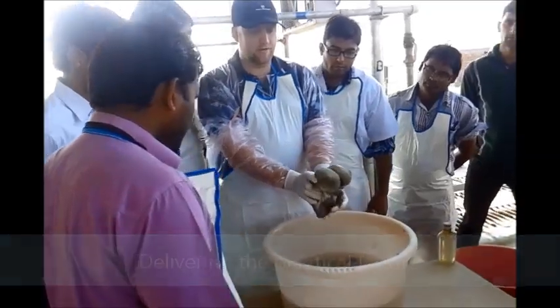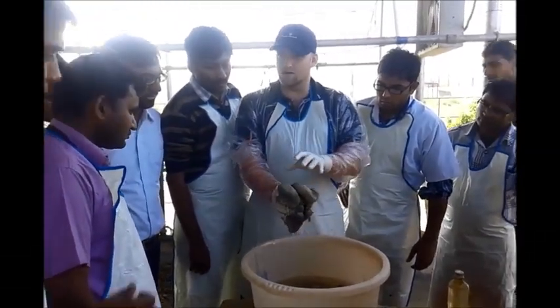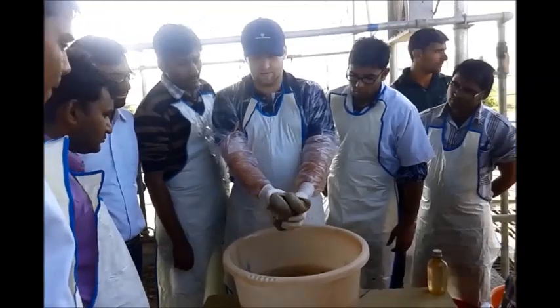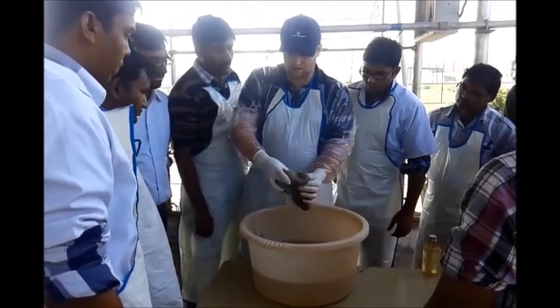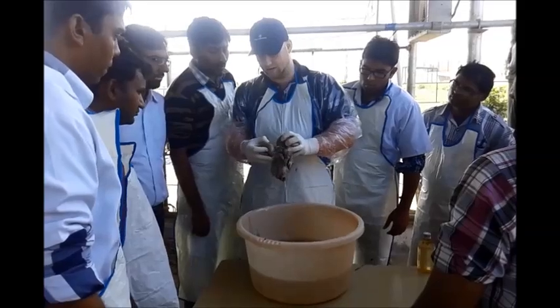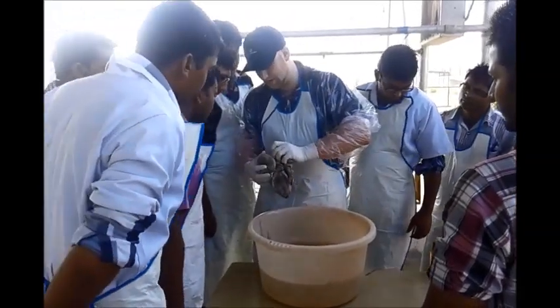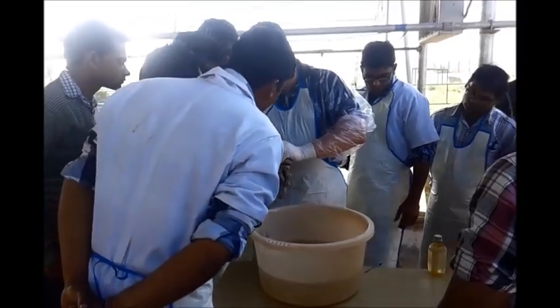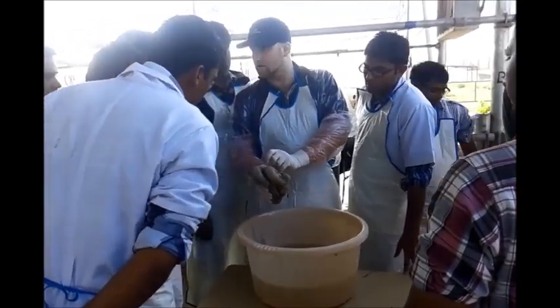At this point I would lift up like this, in an early pregnancy. So we lift up, move our hand forward and get beneath that lower ligament. We need to get in below here, not here. If we pull here, we can break.